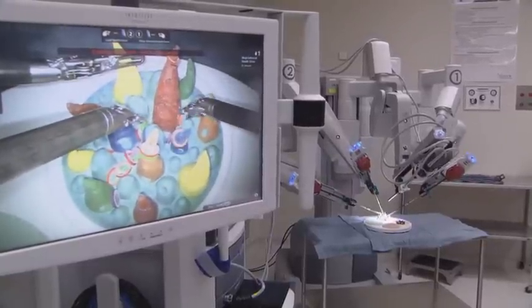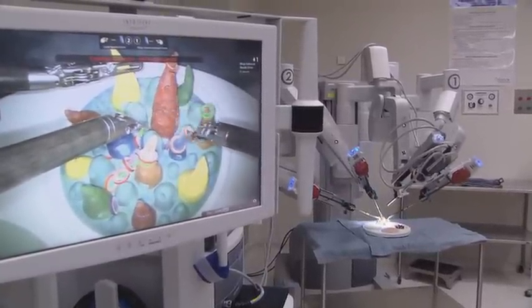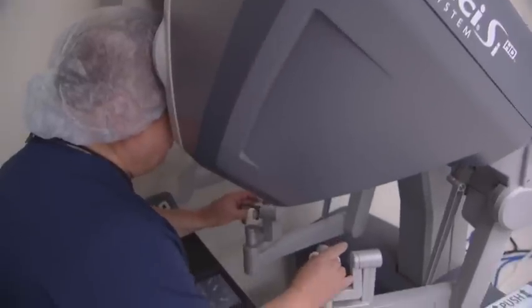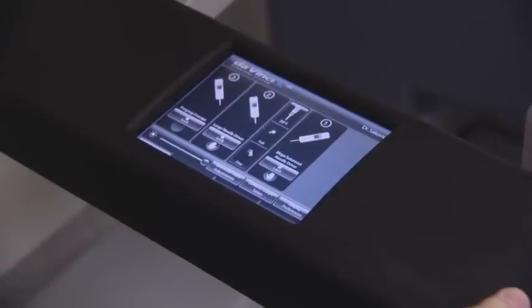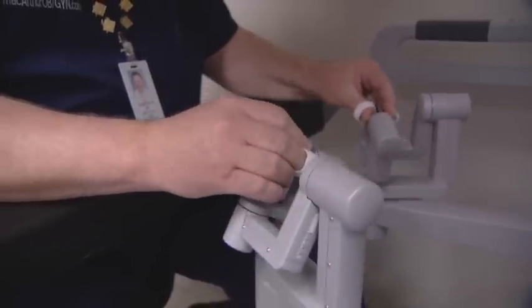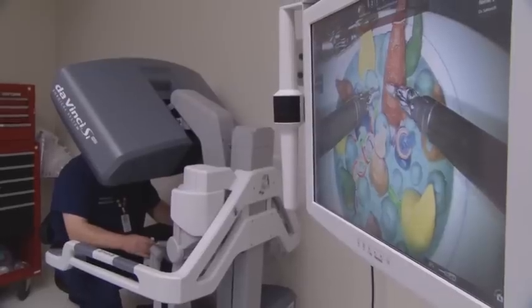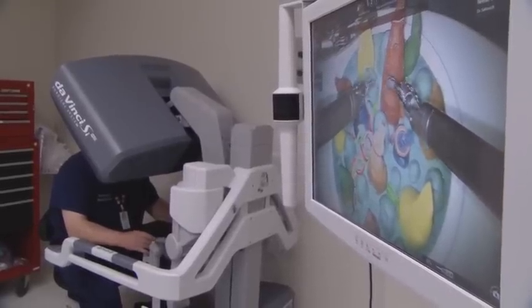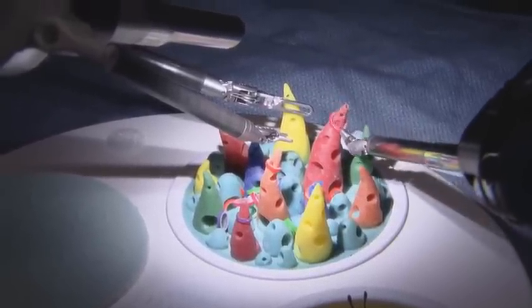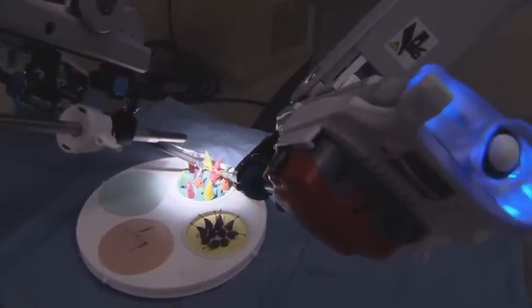When we start the surgery, after we dock the robot to the patient, I actually scrub out of the case, take my gown off, and go sit down at the console. The console is the control center where I put my fingers into the little rings that control the instruments. Whatever my hands do, the actual instrument does — when I move my wrist forward, backwards, in any direction, the robot does the same thing with the instrument.